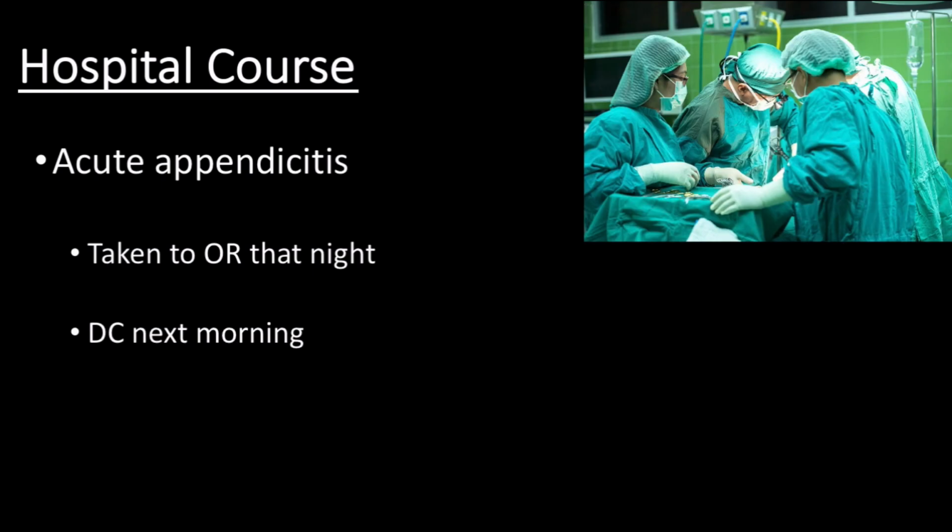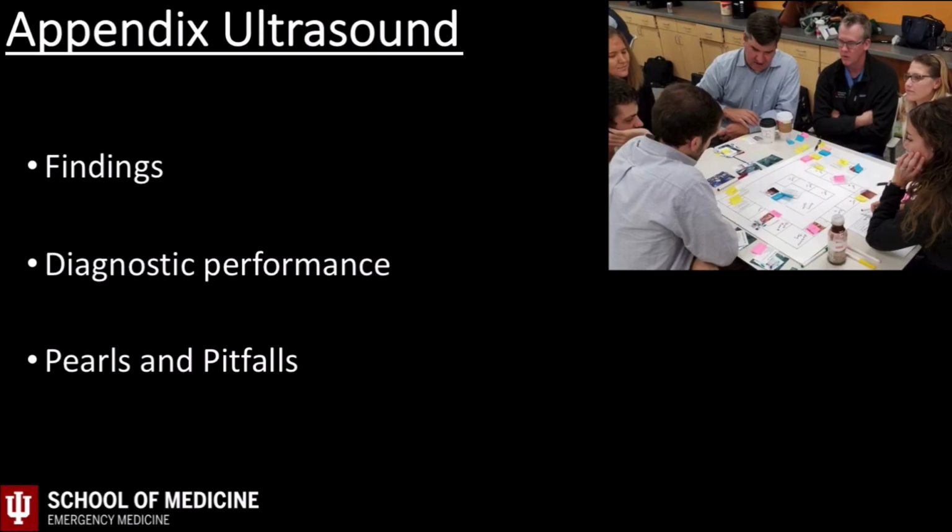The pediatric surgeons took the patient to the OR that night, and he was discharged after an uneventful course in the morning, less than 24 hours after his initial ED visit. Dr. Lupo was able to rapidly confirm his suspicions with bedside ultrasound and effectively disposition the patient without waiting on a formal radiology study or without ordering cross-sectional imaging with its increased cost and radiation exposure.